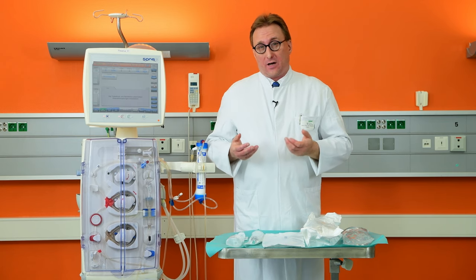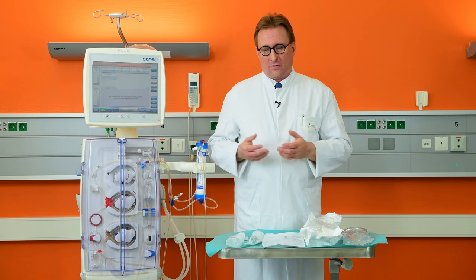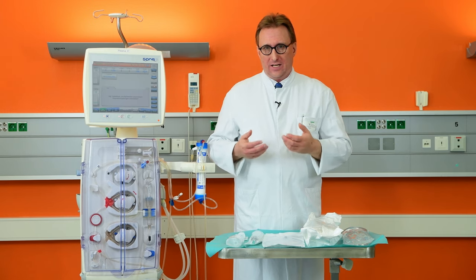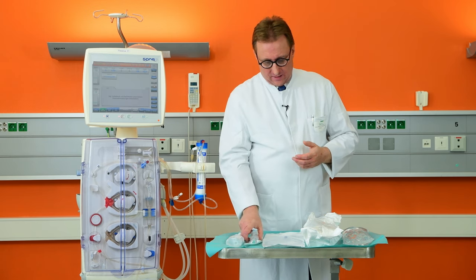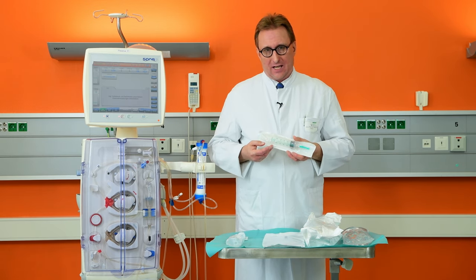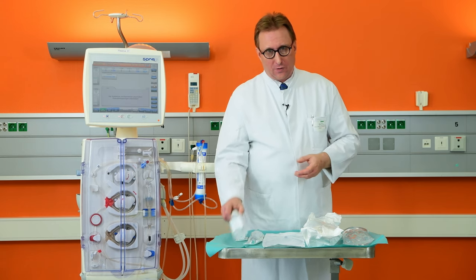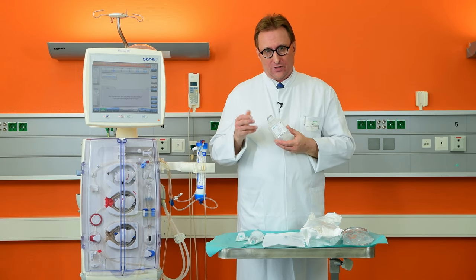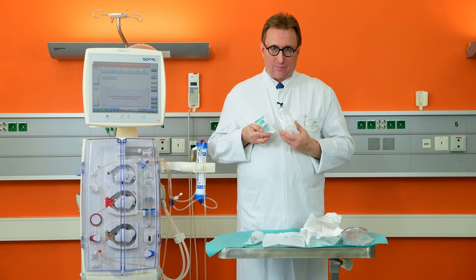In case there are stubborn gas bubbles forming in the filter or the blood tubing, you need additionally three more things: a 40 to 60 mL syringe filled with normal saline, which should be accessed using a mini spike.